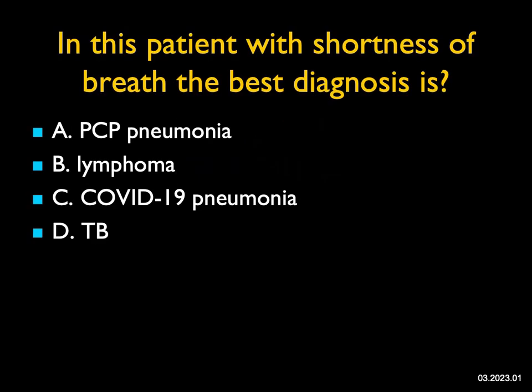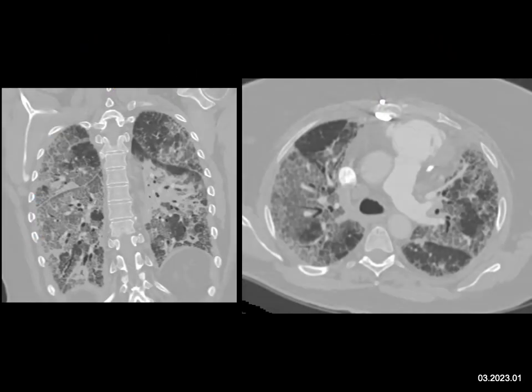In this patient with shortness of breath, what's the best diagnosis? When you look at the axials and the coronal views, you can see very nicely these ground glass infiltrates with their bronchograms. There are no pleural effusions, essentially no bronchiectasis, and maybe a tiny node in the right hilar region, but no adenopathy of significance. It looks like an infectious etiology.